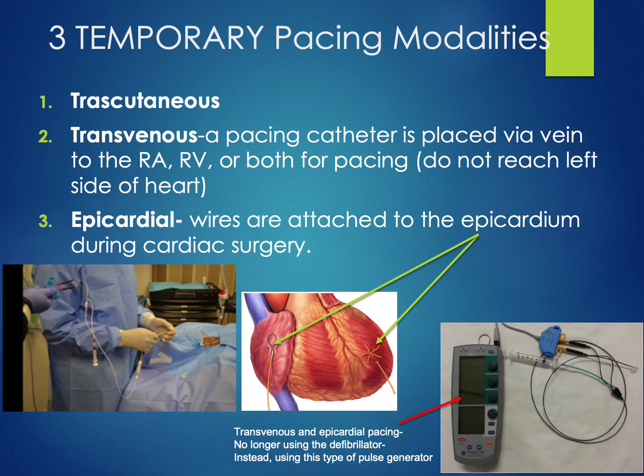So just be sure you're aware of what each of these temporary pacing modalities is and some of the risks and benefits involved that we've talked about.